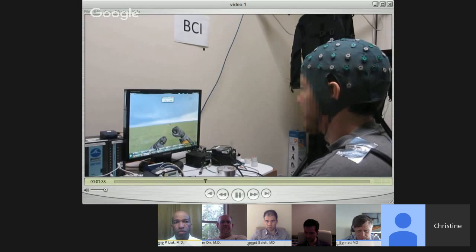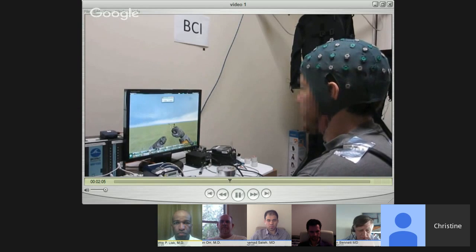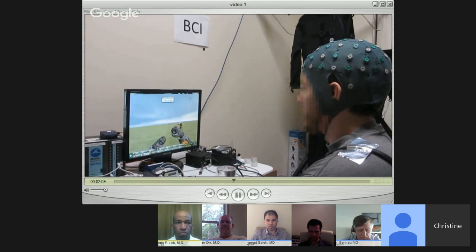What he does to stop is simply stop thinking about walking. And the great thing about using our brain-computer interface is that it's completely data-driven. So we filter out all the other signals that are associated with different types of movements besides just the ones dealing with walking. And the other thing you can see is he's able to perform this in real time and have almost instant, immediate, perfect control, showing that our data-driven algorithm is really able to easily adapt to his signals.